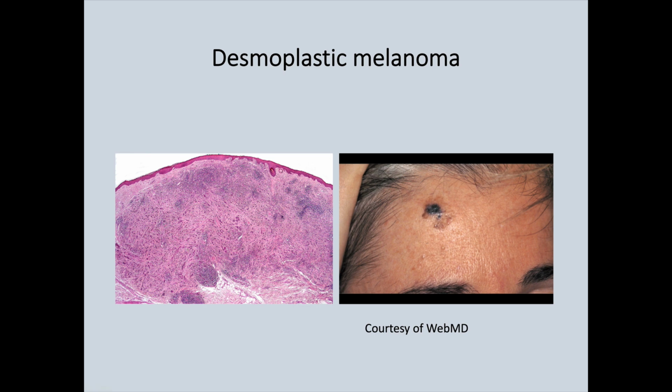You can see the clue. One of the clues are these huge lymphoid aggregates. If you have a melanocytic lesion with those, well, woe betide if you start thinking of benign. Start thinking of malignant until you can prove it isn't, which won't really happen, I don't think. But anyway, you can see that there are spindle cells and there's this intense desmoplastic stroma.